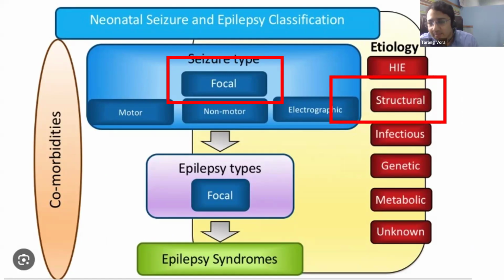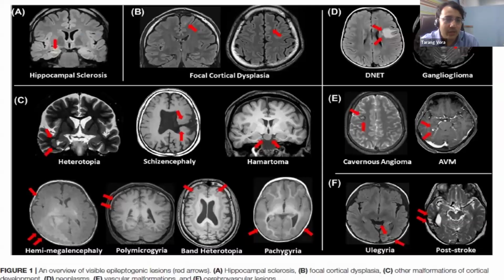So when I get a patient for epilepsy surgery, all of this has been ruled out by our epileptologists, who are extremely good in diagnosing and finding out what type of epilepsy it is, and they are able to tell us. They have that guess that it is structural, it is none of this, but we are just not able to see it on the MRI, and that is where the image post processing tends to help.